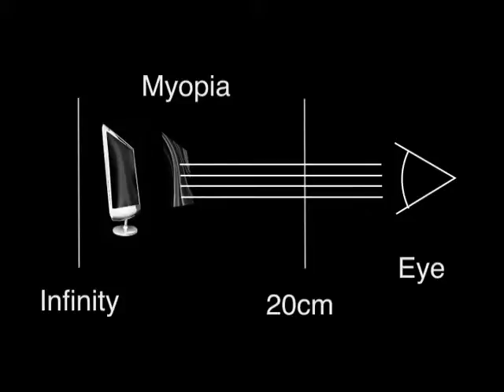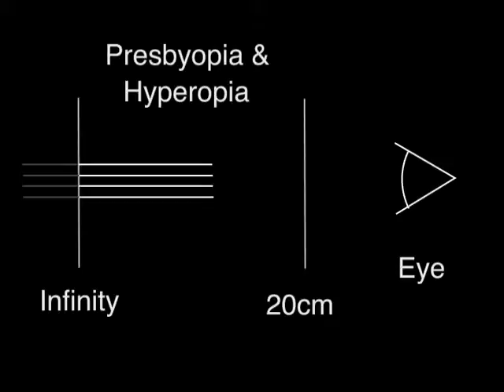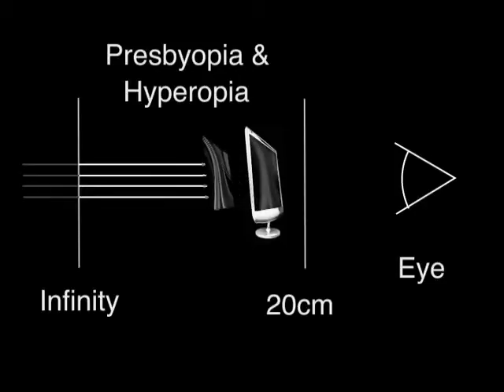inside the focal range. When the focal range shifts away from the eye, any information closer, such as an ebook reader, will become blurred. In this case, the tailoring process moves the image away from the eye and back inside the subject's focal range.